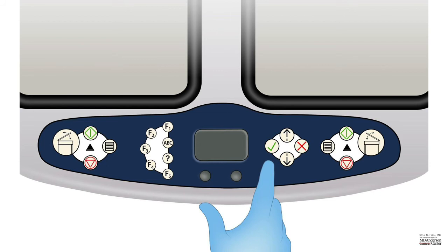That contact time will be defined by the manufacturer and the facility using the disinfection process, and one should make sure that you should not cut short the amount of contact time required for high-level disinfection.